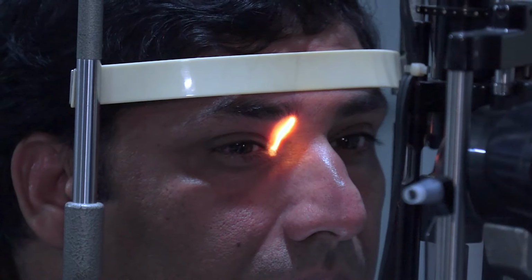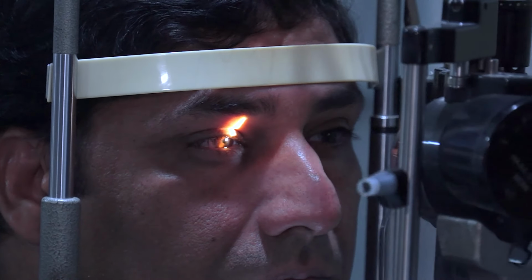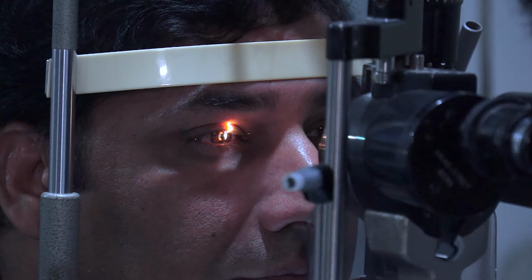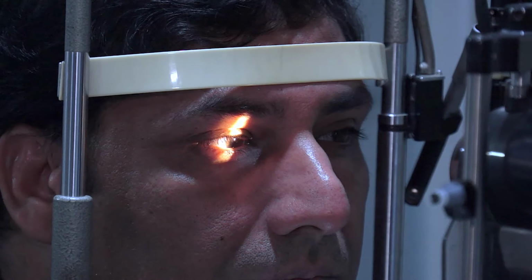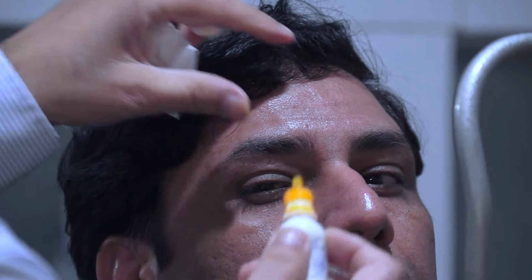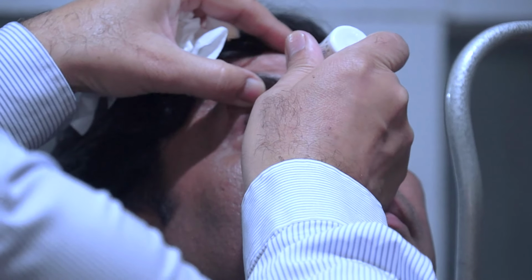After completion of this examination, we have to check the intraocular pressure, in which case we stain the tear film with a fluorescent stain.